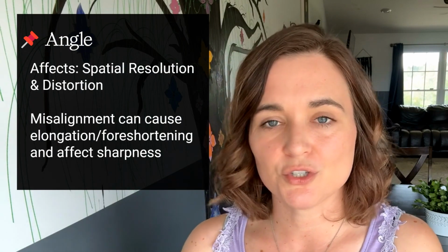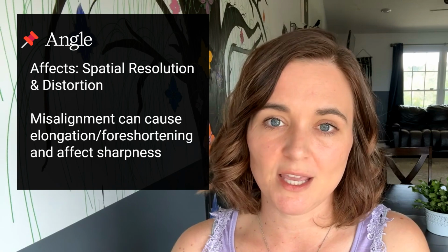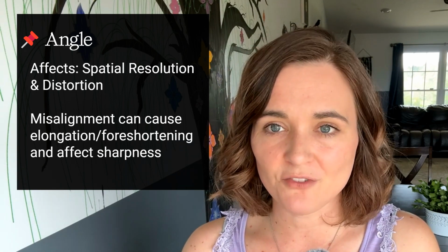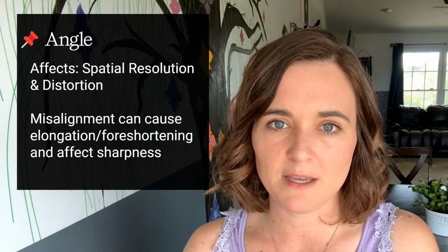Your angle. This is your tube, part, and receptor alignment. This affects your spatial resolution and distortion. Misalignment can cause elongation, foreshortening, and affect sharpness. Here's a tip. Keep tube-part-IR alignment consistent. All right, that's our full walk through the ARRT image quality chart. Let's hit a few wrap-up points and test your knowledge with a few more quick quizzes.